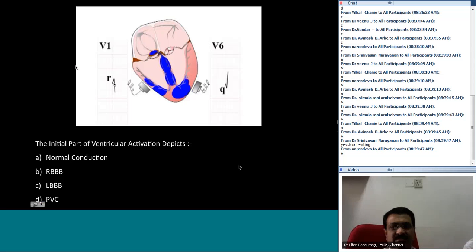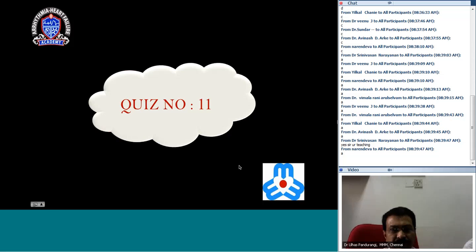Great. So do we have time for some more? I believe yes. So we go to another quiz here.